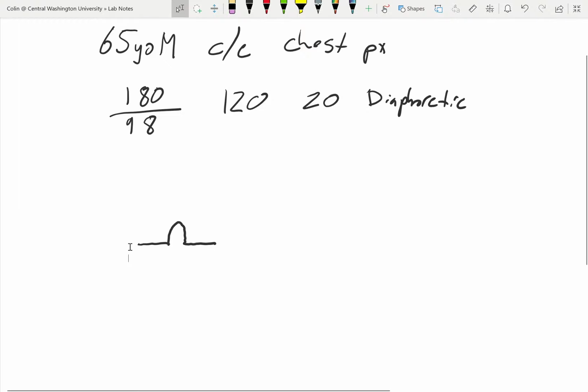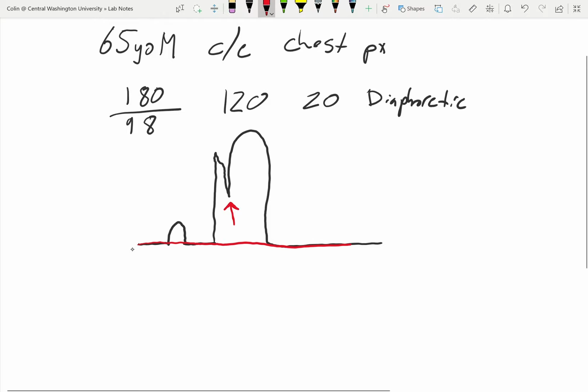But what you're going to notice pretty quickly is that when the ventricles beat, there isn't a nice triangle anymore. So that would be normal, right? That's what we're looking for. What you're going to notice is that it goes up like this, it comes down and then goes like that. And what we're really concerned with is this part right here. If you notice, that part didn't come down to the baseline. And the baseline is, again, this portion right here, that flat, no electrical activity.